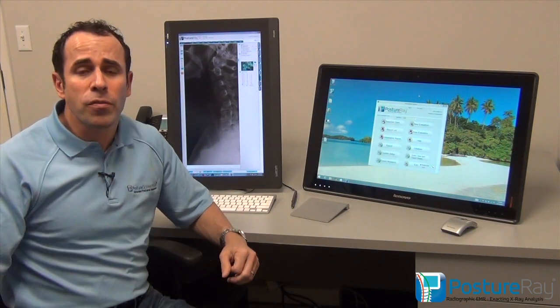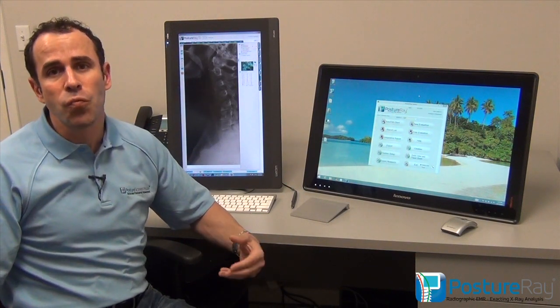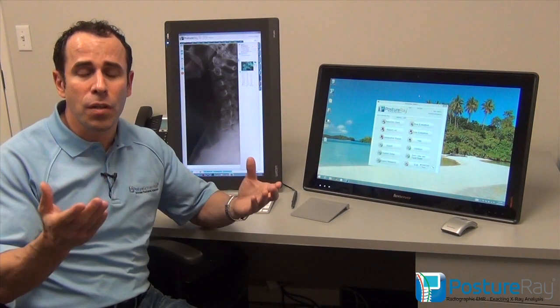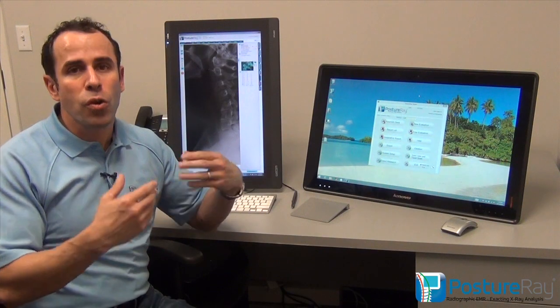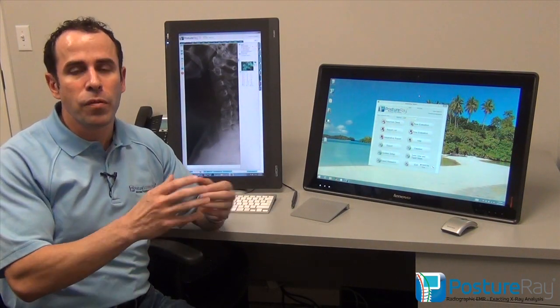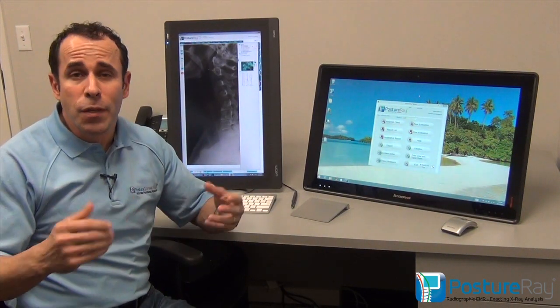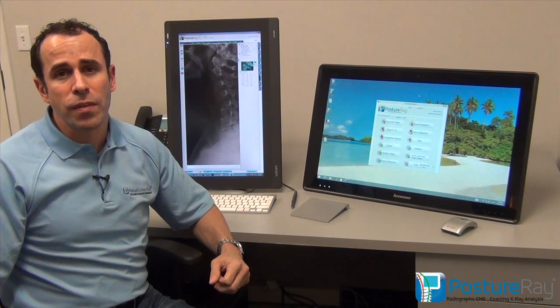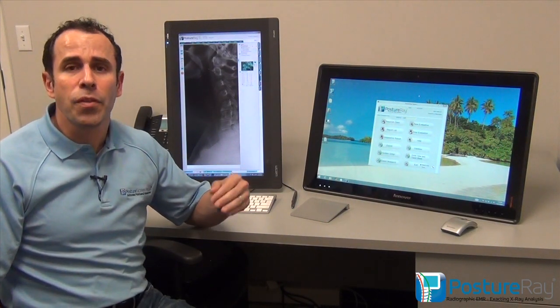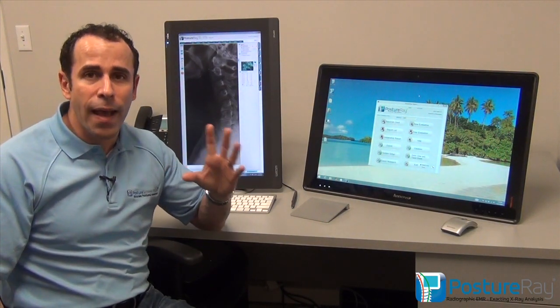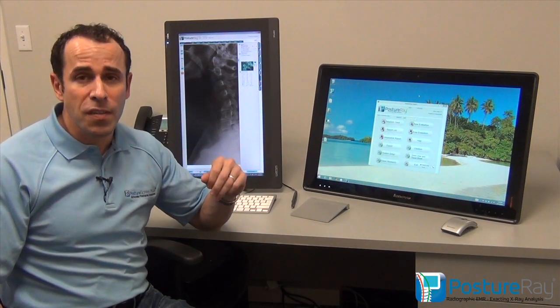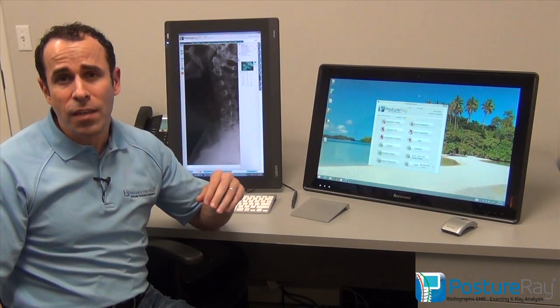No other system, no PACS can match what we have. As a matter of fact, if you have a digital x-ray system, we work with your existing PACS to pull those DICOM images in. If you don't have a digital x-ray system, no worries — we have a proprietary method where we can actually calibrate standard photographs of your existing x-rays.